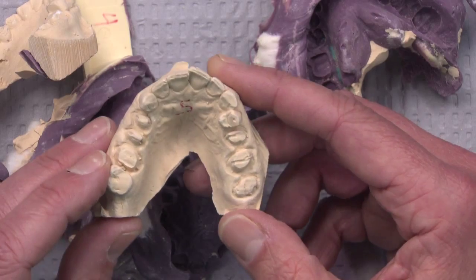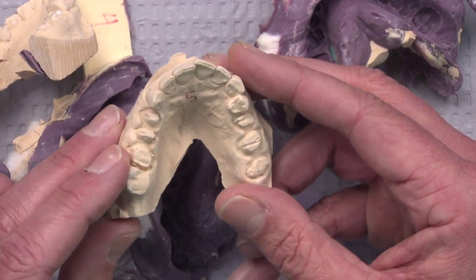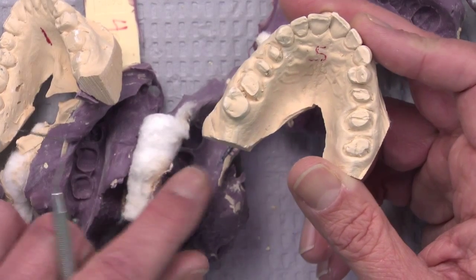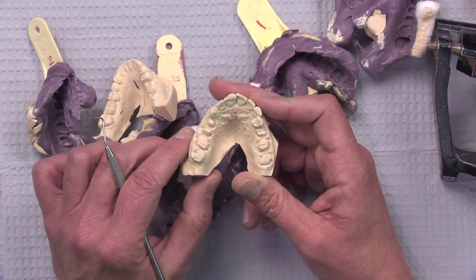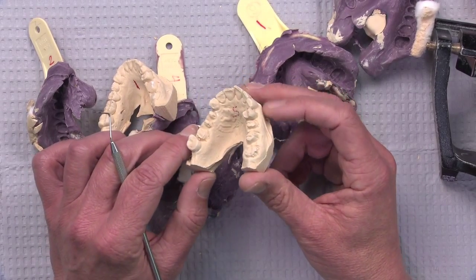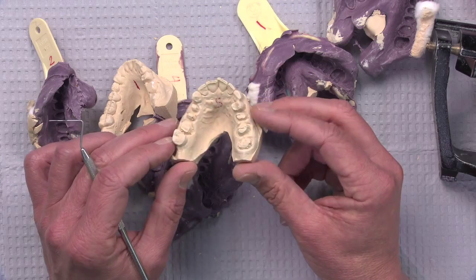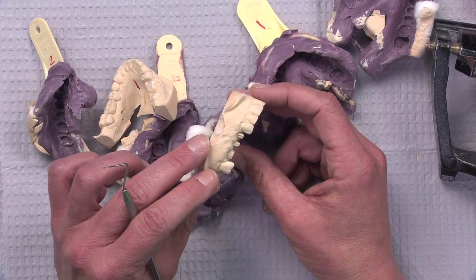So I get not wanting to pack cord, but if you don't pack cord, you've got to hop in there with a diode laser and do something, because just trying to force 1 viscosity of material, or even 2 viscosities of material, even if there was some extra light body in here, it's just difficult to force it down into a wet sulcus with a hydrophobic material. So no problem avoiding the cord, but you're going to want to grab that diode laser. And really, as soon as this tissue's cleared up from around these teeth and we get a good impression, this is going to be a great case for this doctor, because the preparation looks really nice.